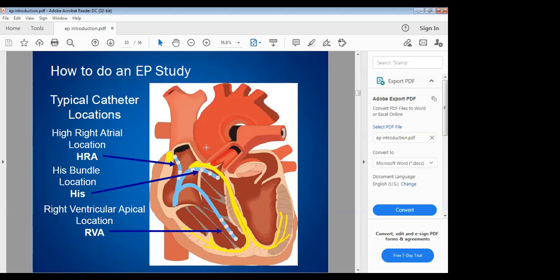So I'm sure Dr. Jim can get back to that question and see what that definition means. At least it will be clearer now. Yes, sir. I think Dr. Jim is clear. From the time you paced the last time until the time you waited for the patient's intrinsic SA node to recover. Okay, sinus node recovery time. I think that one is done, so we can move on.